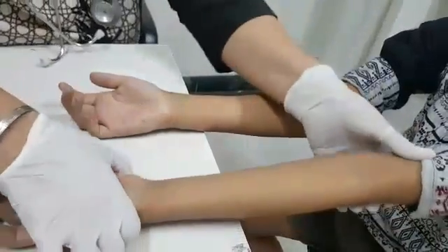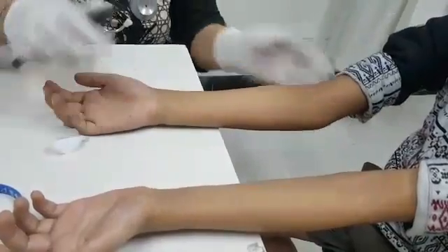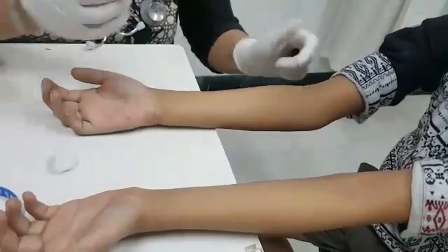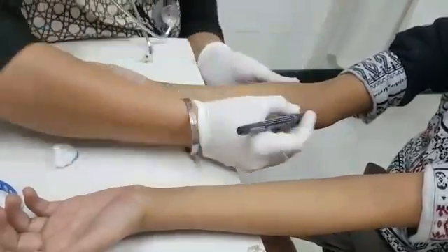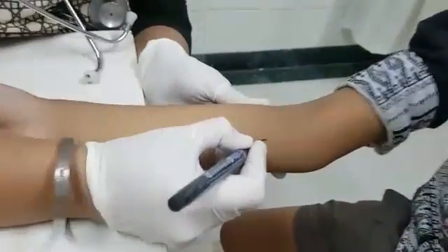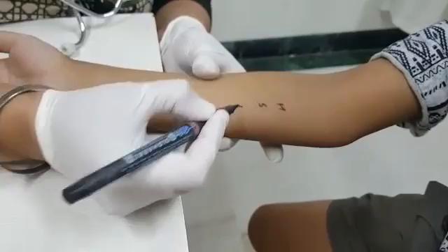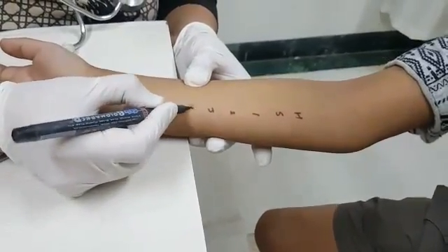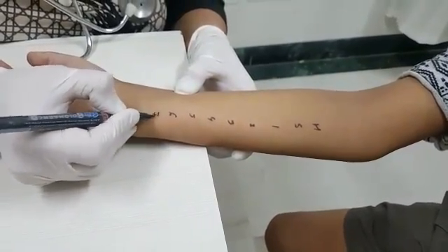When we have already cleaned it thoroughly, we tell the child to put his forearm like this and we start marking on the arm. We mark the space here — this is the marking we normally do. This is the normal control, and then the other allergens. I am doing around 30 to 36 allergens — a few are aero allergens and a few are food allergens.